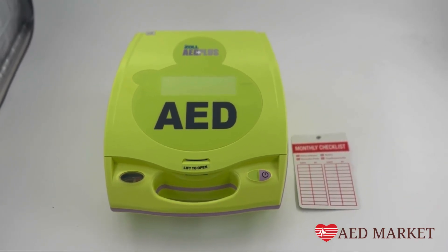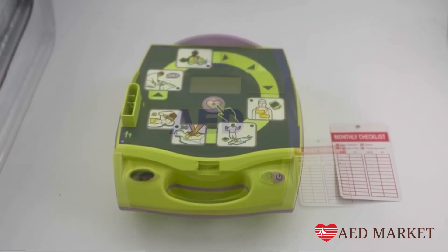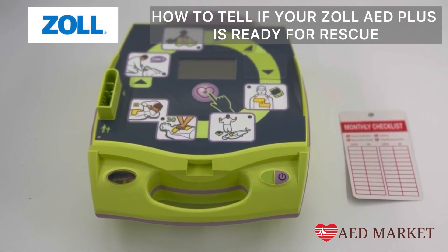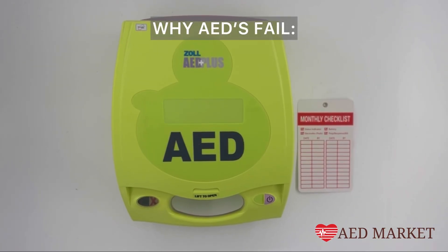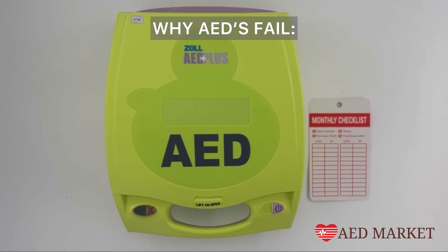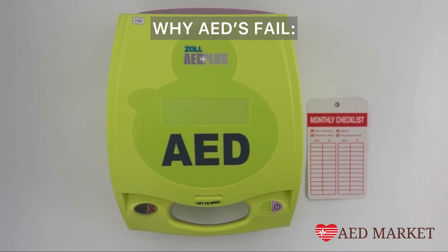This video is presented to you by AEDMarket.com. Today we'll go over how to ensure that your Zoll AED Plus is ready for rescue. It's important to remember that an AED not functioning properly is as detrimental as not having one at all. Regular maintenance is key to avoid failure.